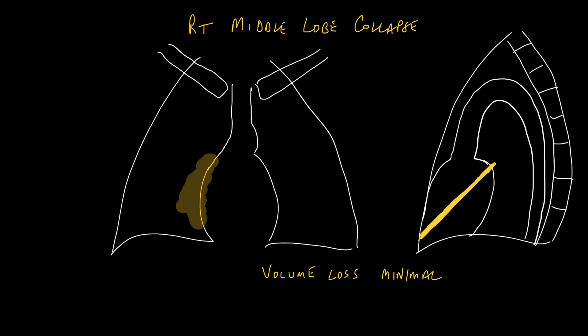In a right middle lobe collapse, the hazy shadowing caused by the collapse of the middle lobe abuts the right heart border, making it invisible. And on the lateral view, quite often you see a quite marked collapse of that lobe.